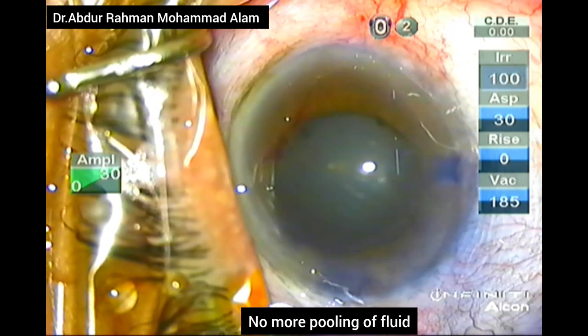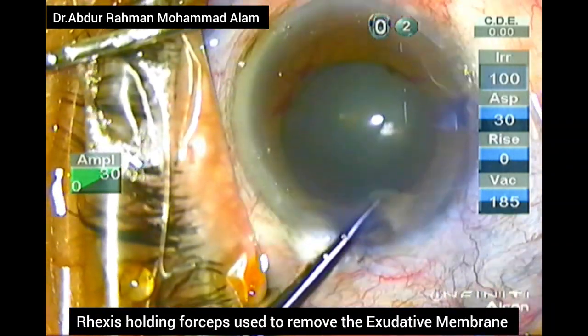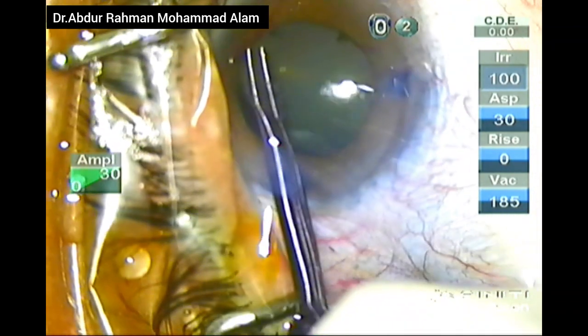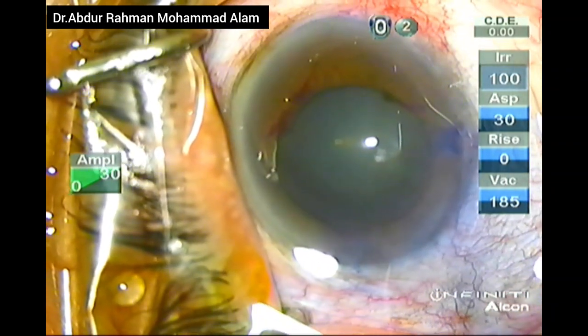Wash the Trypan Blue with adrenaline to cause more dilation. Then OVD is injected to cause viscomydriasis. I am using a Rycroft cannula to take out the exudative membrane, but I was unable to do so, so I am forming the AC again.